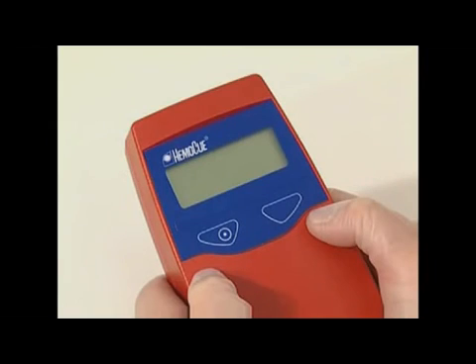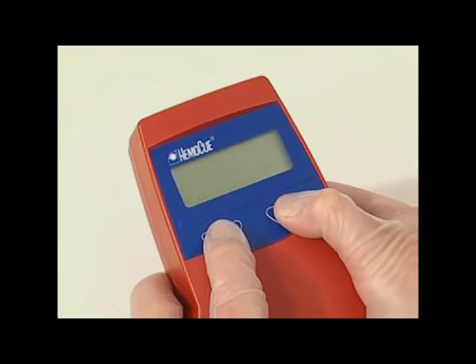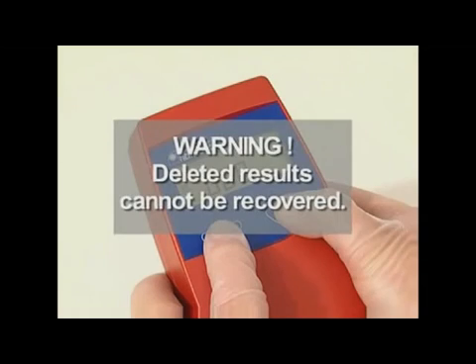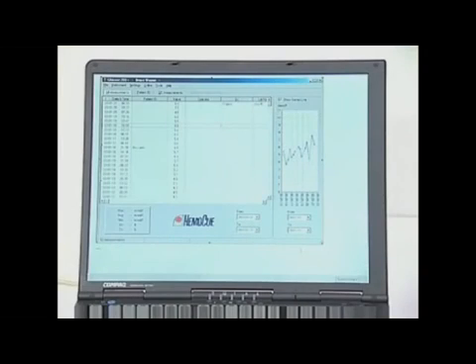To delete all stored results, hold both buttons down at the same time for five seconds. The display shows the waste bin, the warning triangle, and the total number of results stored. Results have now been deleted. Please note that deleted results cannot be recovered. If results are to be saved, they must be downloaded to a PC before starting the deleting process.